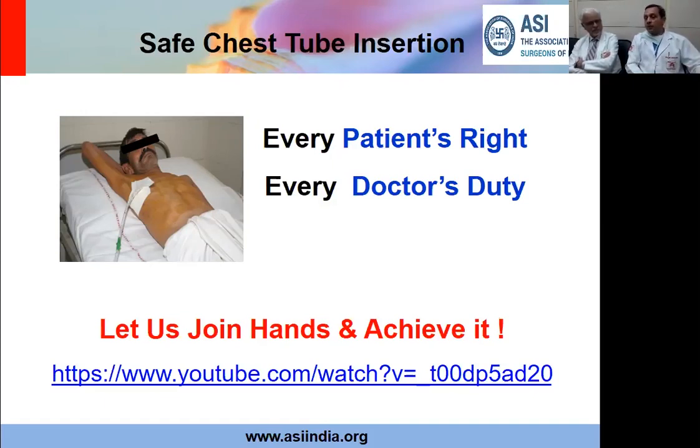But should that happen, the patient may bleed outside or may bleed inside. If the patient is bleeding outside, then you have no choice but to ship the patient to theater and have proper exposure in the theater. Usually it may not be possible to do it under local; some kind of anesthesia support, not saying intubation, but some kind of anesthesia support is needed. You have to have proper light, proper asepsis, all your instruments available, and then you enlarge the incision a little bit, see the bleeding site and underrun it.